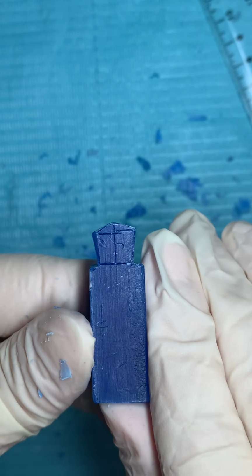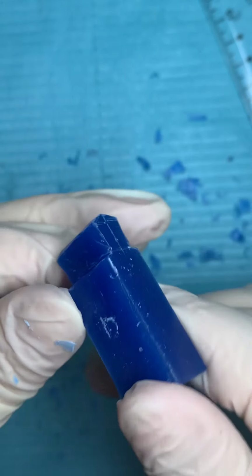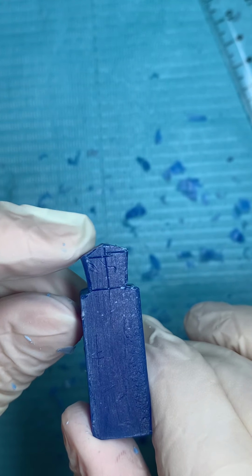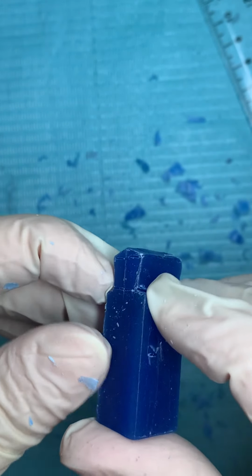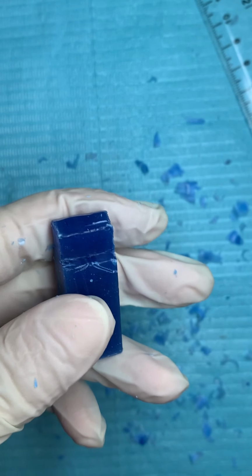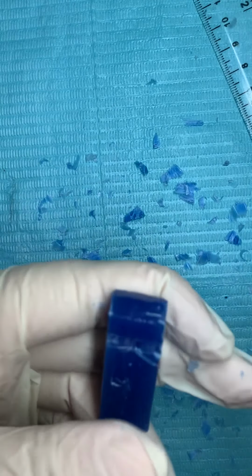Now I finished the cutting of the first step. As you see here, my distal slope is longer, okay, my mesial slope is shorter. I have my trapezoid. I'm going to proceed for the second step, which is the step of the height of contour, right?